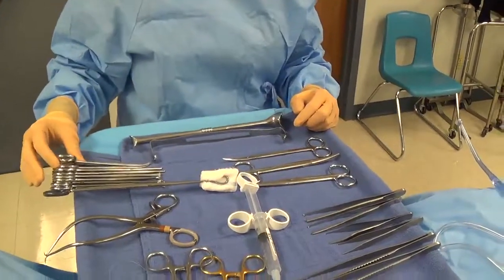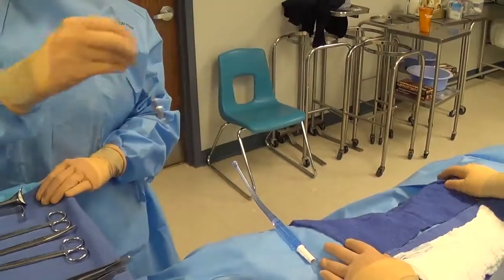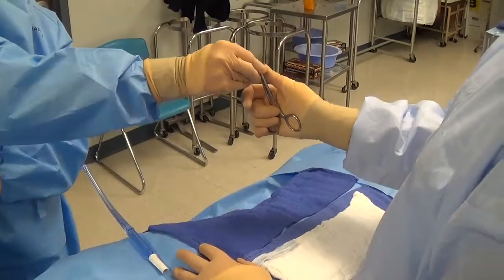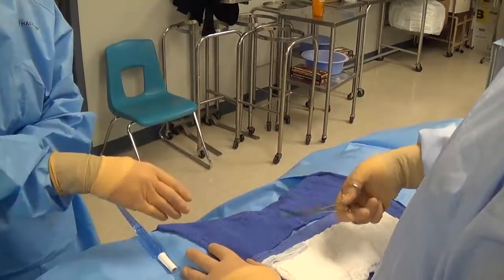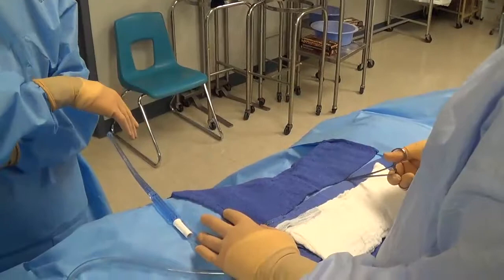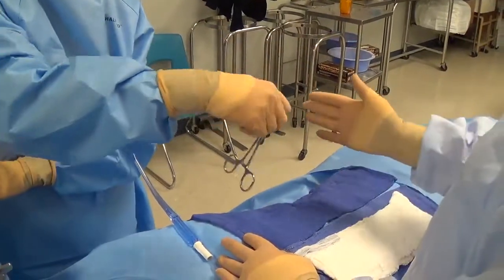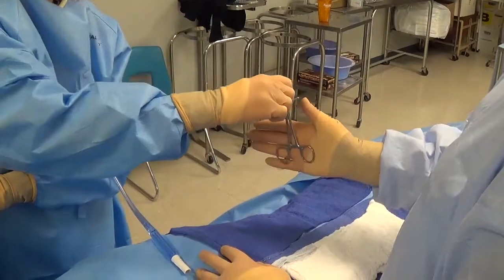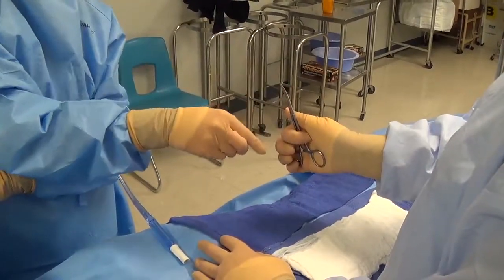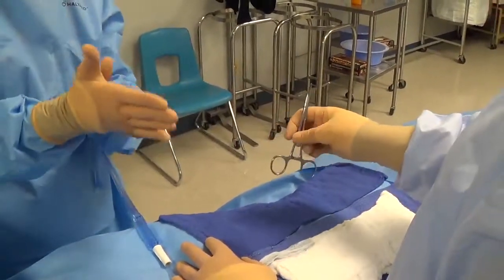Instruments are handed by the surgical technologist to the surgeon — we don't just hold it here and wait for the surgeon to come get it. For a ringed instrument, it's a wrist snap that places it into the surgeon's hand so they don't have to take their eyes off the field. If you just hold it and wait, they'll have to look away and refocus. Use a firm motion — if it's too light there will be confusion about who's holding on and the instrument will hit the floor. It's a snap of the wrist so it goes into the palm of their hand.